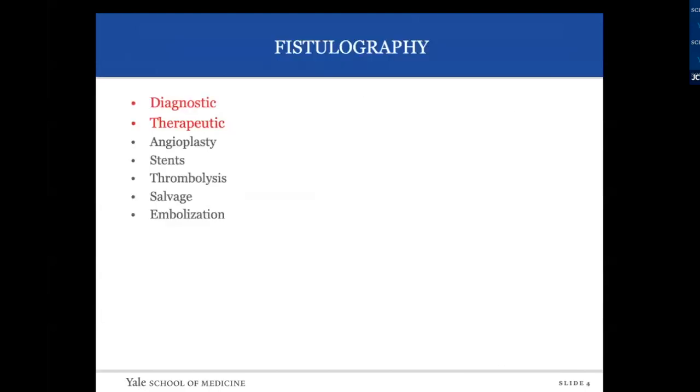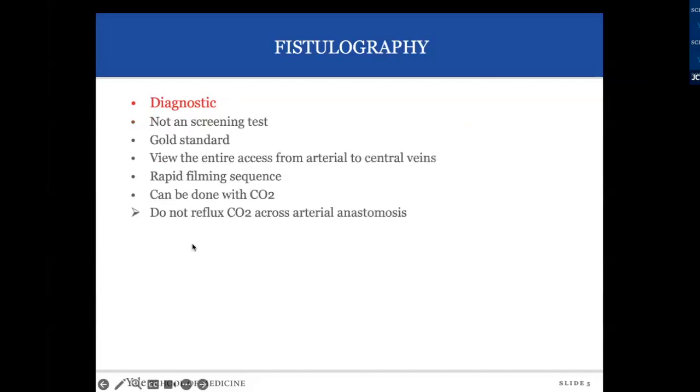So why do we do fistulogram or evaluate fistulas? Because at this point, we're not doing it for diagnostic purposes in a sense. Most of those patients that are sent to us are because their fistula is not working well, or because their fistula is having some issues during dialysis. So mainly we're doing it for therapeutic intervention, but obviously we will have to know where the problem is. And then all the other stuff comes with dialysis intervention.